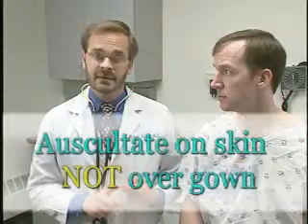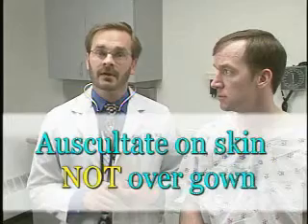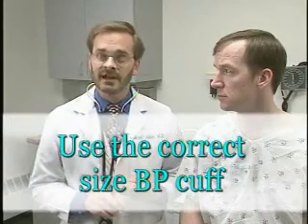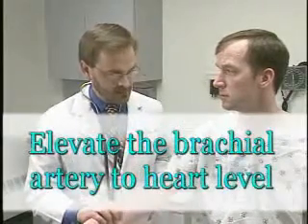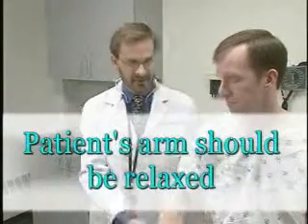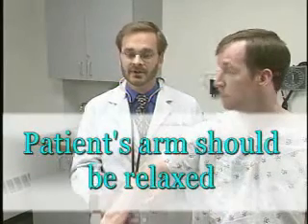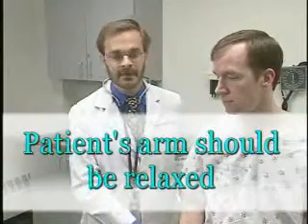First, again, checking the auscultation over an article of clothing or a gown is incorrect. Second, using a cuff that's too small will falsely elevate blood pressure. Third, not elevating the arm or the brachial artery to the level of the heart would cause an error. Fourth, if the patient just held their arm up themselves, they'd be contracting their muscles, and that would falsely elevate blood pressure. So again, you as a physician need to help elevate their arm to heart level.